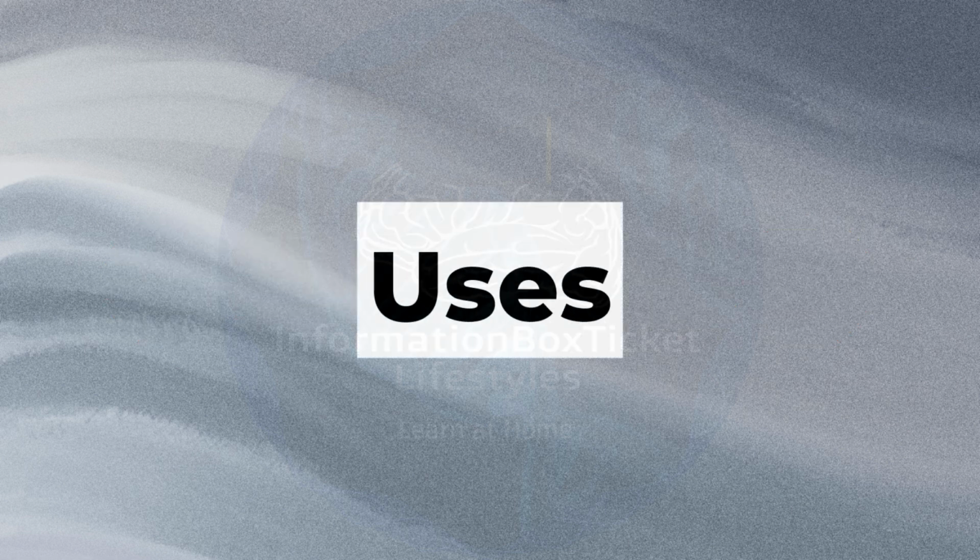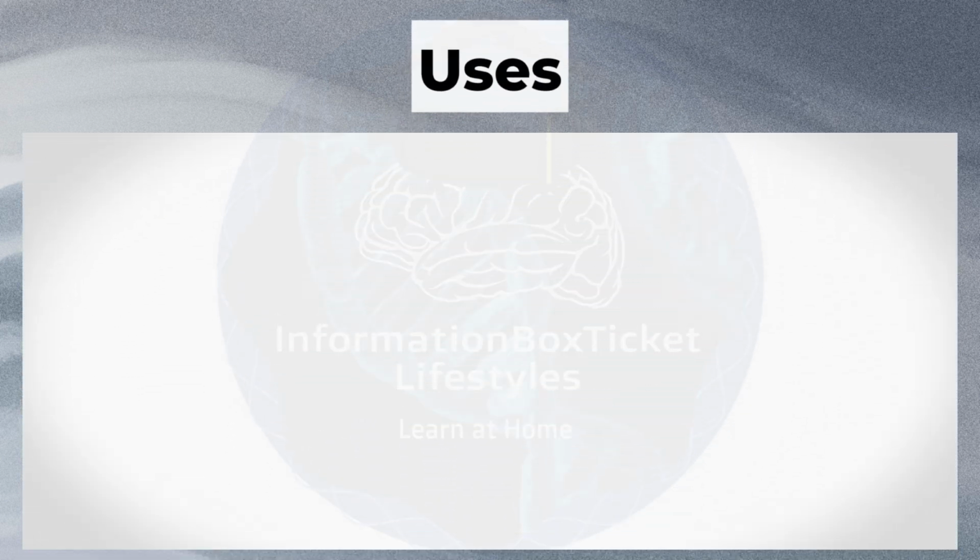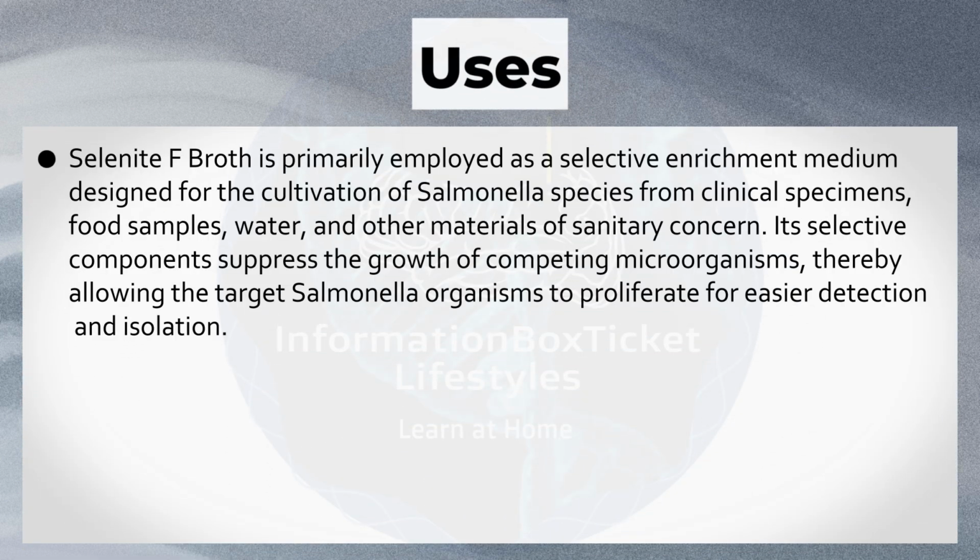Uses of Selenite F broth. Selenite F broth is primarily employed as a selective enrichment medium designed for the cultivation of Salmonella species from clinical specimens, food samples, water, and other materials of sanitary concern.